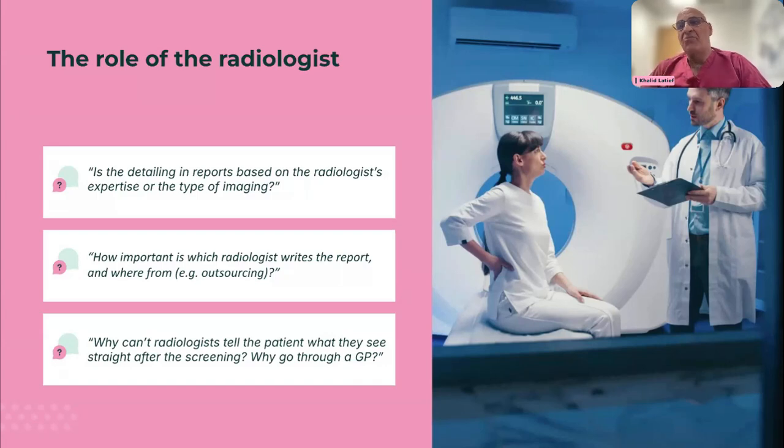If I'm reporting remotely an MRI scan, I've got an MRI scan of a knee on my screen here, for example, the patient was scanned 2 days ago.